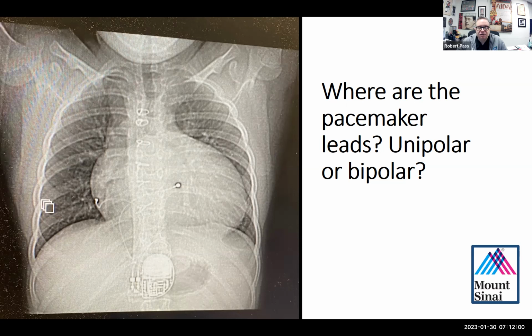The most important reason that we like bipolar leads for epicardial leads is that a number of studies have shown that, as a general rule, bipolar epicardial leads have a greater longevity than unipolar leads. There are a lot of studies that came out of Michigan in the 90s that showed that the longevity of leads was quite superior with bipolar versus unipolar leads.